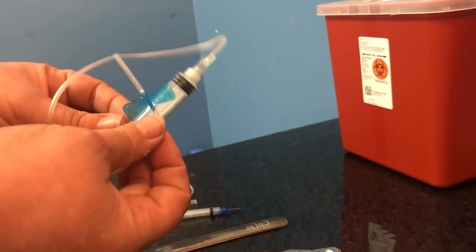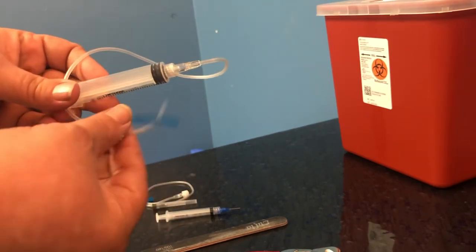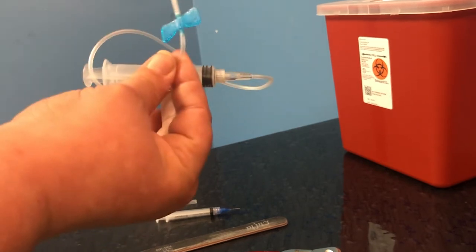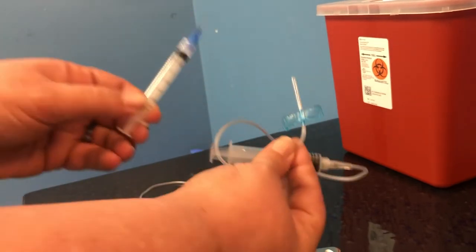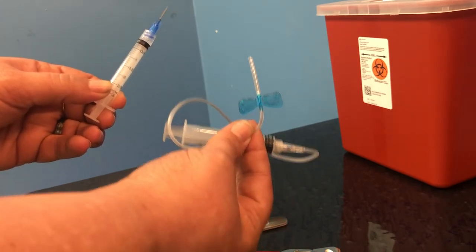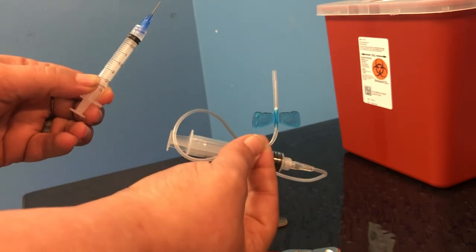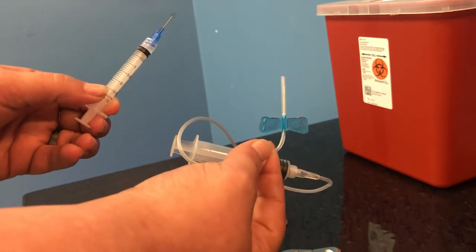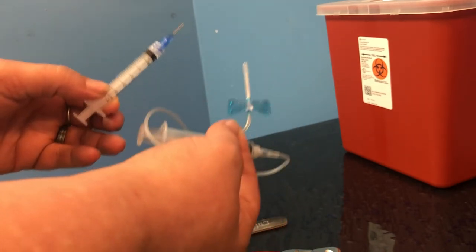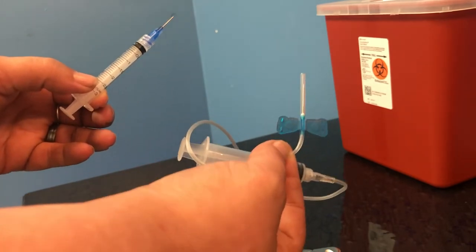But if we have animals that are really specific, which so many of our cooperative vet care training animals are, they're gonna notice that this and this are not the same thing. And they need our help having really detailed training equipment shown to them and for us to be able to simulate as closely as possible what it is that they're gonna encounter and what the variety of items that they may encounter for injection or blood collection would be.